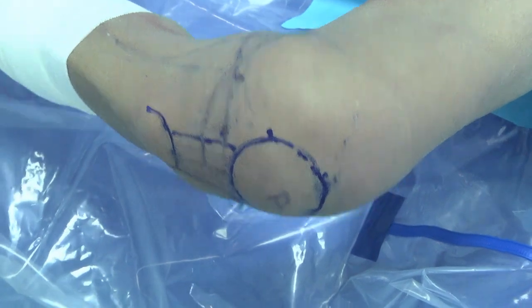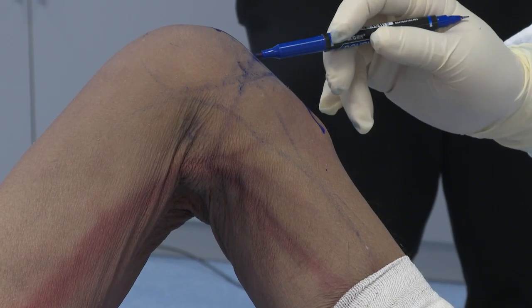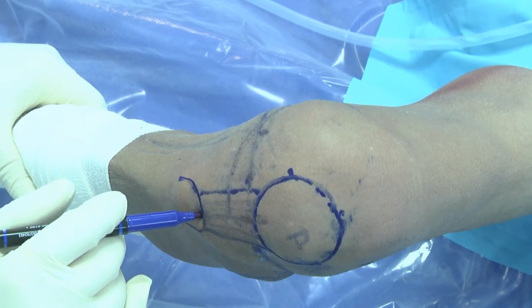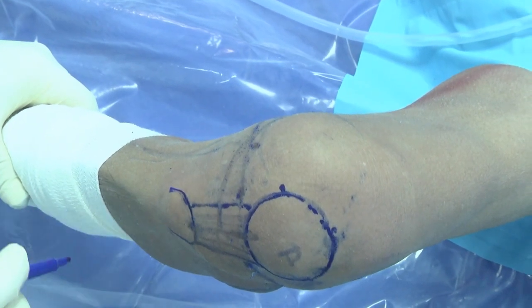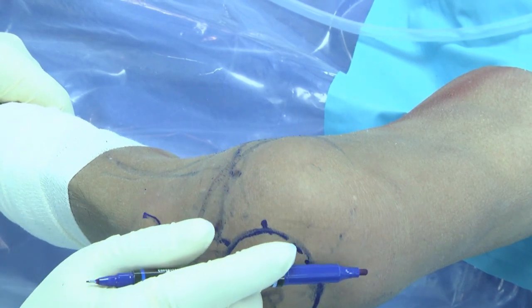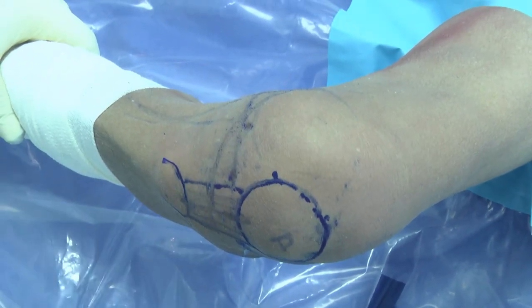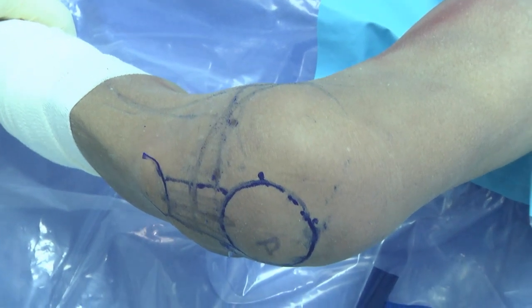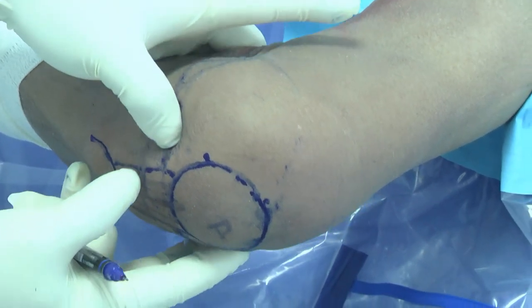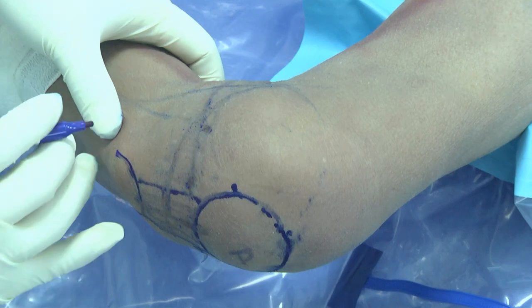So if the harvest incision is vertical or a bit displaced, it may injure the saphenous nerve. And if you harvest the patellar tendon, the patient will get numbness every time, 100%. This also explains why patients have skin numbness after harvesting. Or if you do total knee replacement, the patient also has numbness because you always cut this nerve. The way to avoid this nerve injury is that your incision should be lower and transverse. Then you'll be safe.